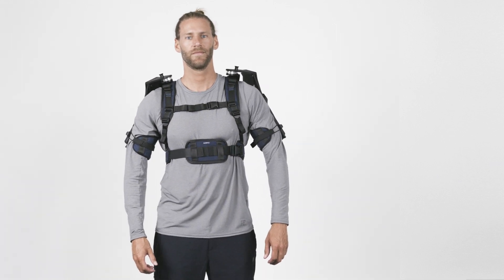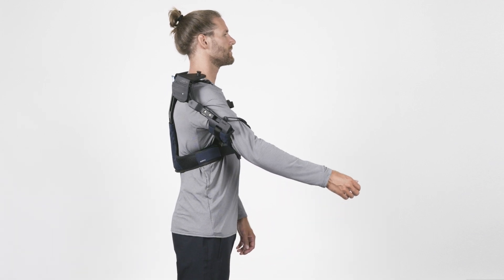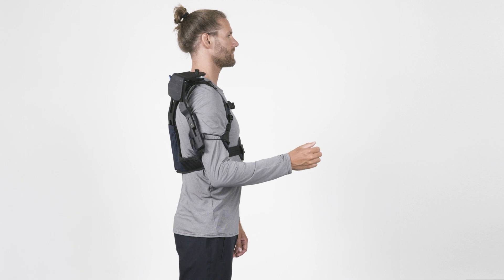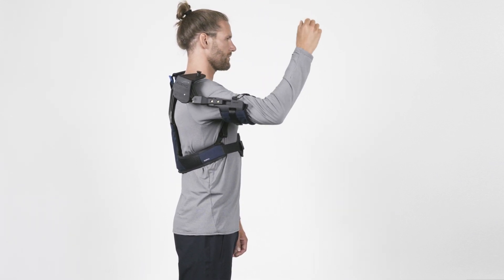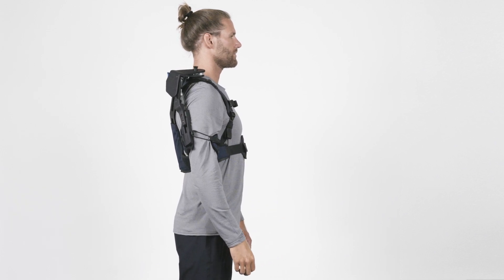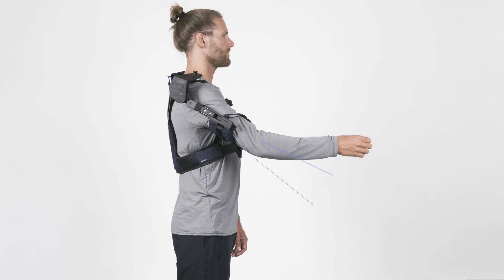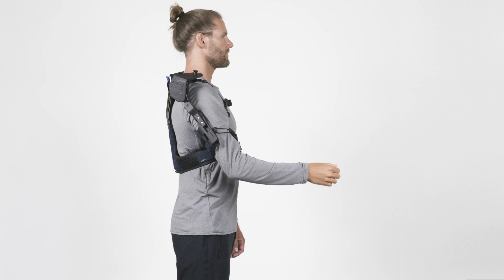Once the suit is adjusted, it is time to familiarize yourself with the support it provides. Lift your arms and the DeltaSuit will automatically start supporting you. The support depends on how high your arms are lifted. When your arms are lowered, there is almost no force, allowing you free movement. Only when you raise your arms will the support increase, with maximum support being provided around shoulder level.